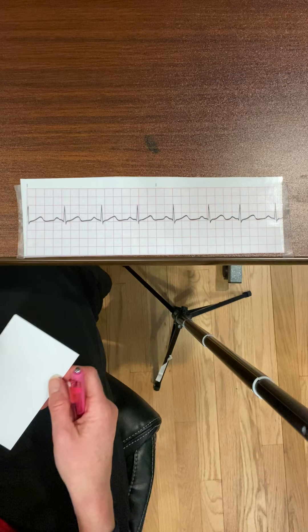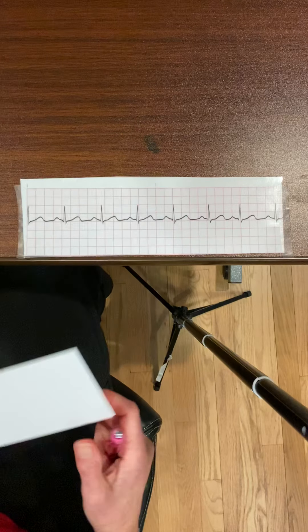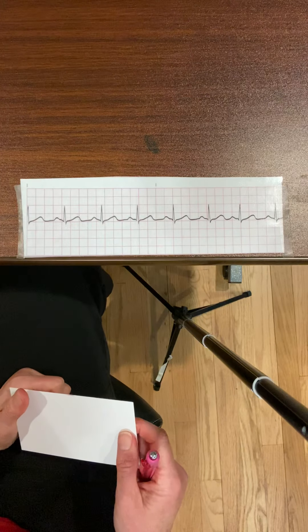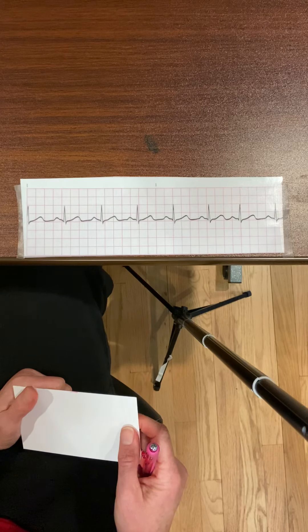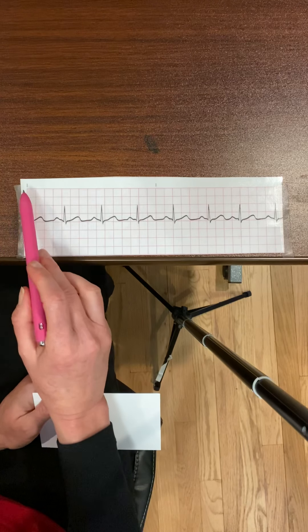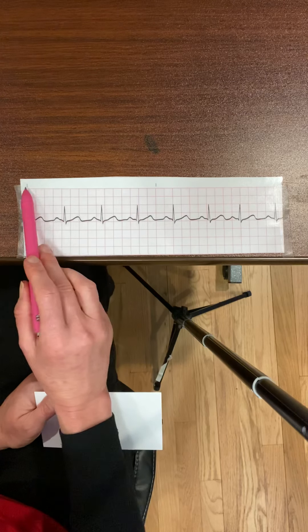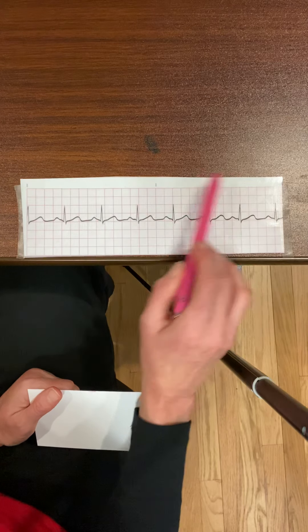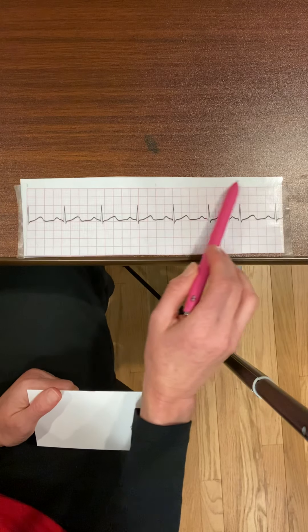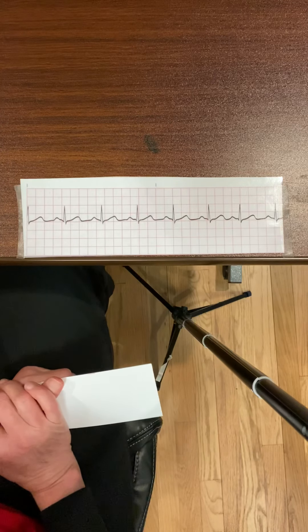Hey, hello everybody. I'm going to teach you how to interpret a rhythm strip using just an index card. The first thing I want to do when looking at a rhythm strip is know if this is a six-second strip. I can see that this is a six-second strip because there is a small line here and a small line here, so in between these two small lines there is three seconds, and between the next two small lines is also three seconds — so this is a six-second strip.